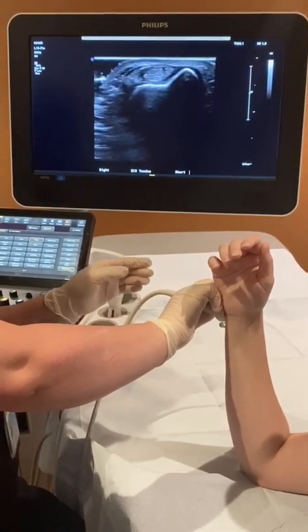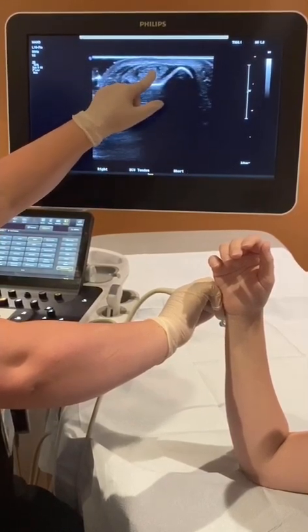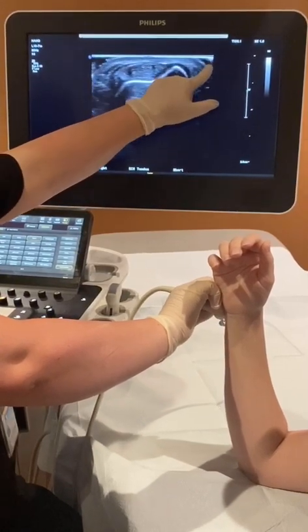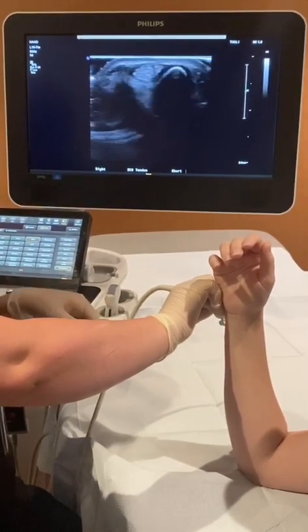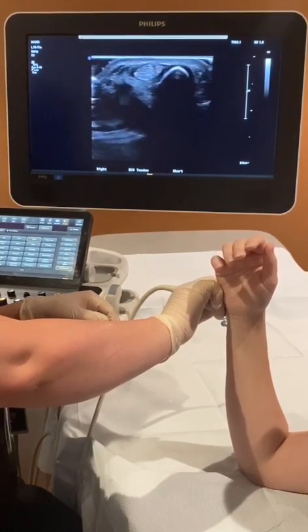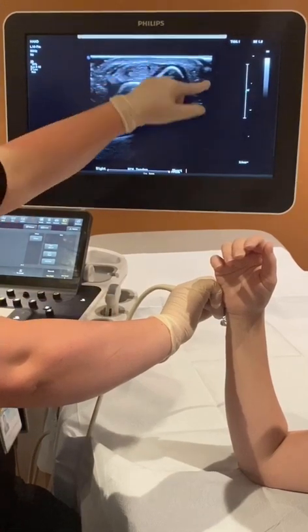In this picture you're going to see the ulna and the ECU tendon. This is the ulnar side of the screen and this is the radial side of the screen. When you do dynamic evaluation, what you're looking for is any subluxation or dislocation over the ulnar side of the screen.